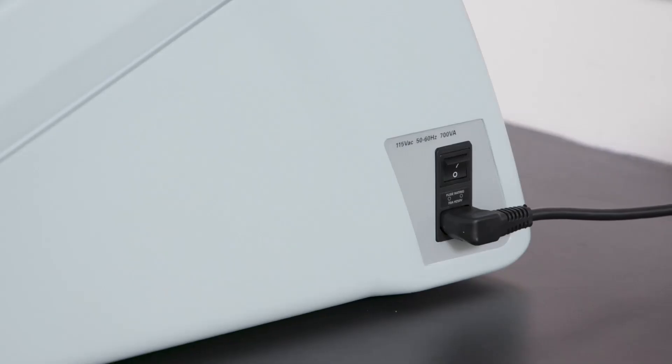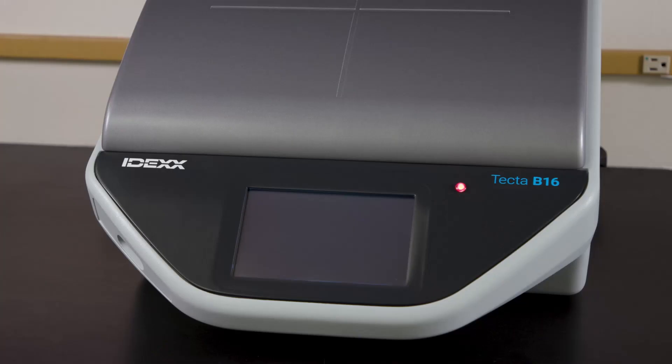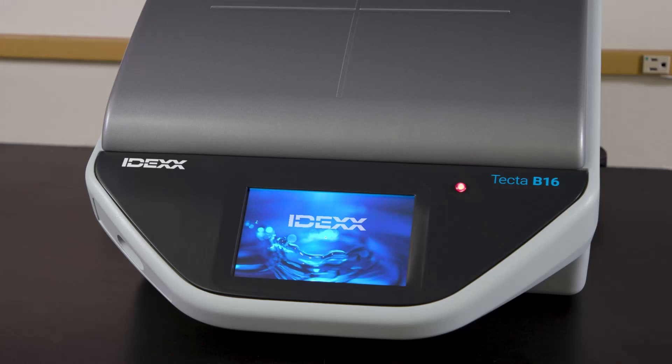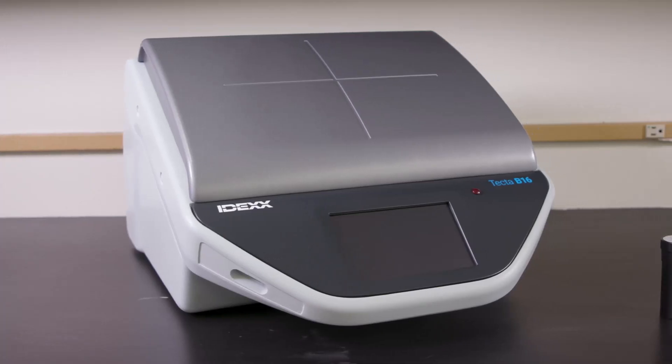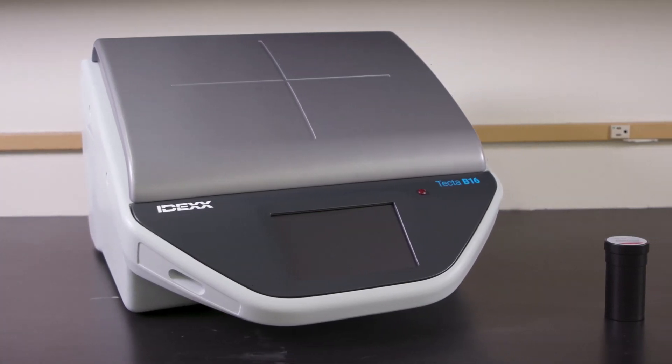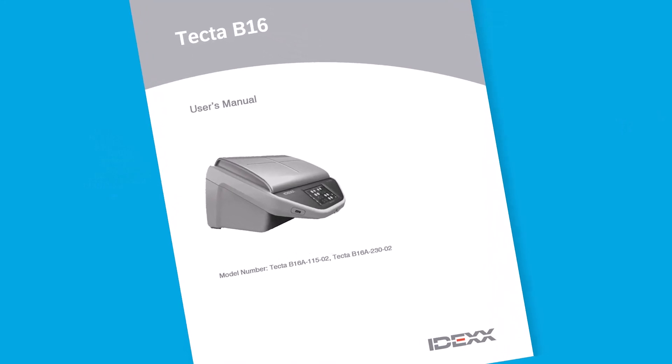To begin, power on the TECTA B16 using the toggle switch located on the side of the instrument. The screen will take about one minute to return to the overview screen. Validating each sample chamber with the validation cartridge is recommended monthly, but is not required before each sample run. See the product insert for more information.